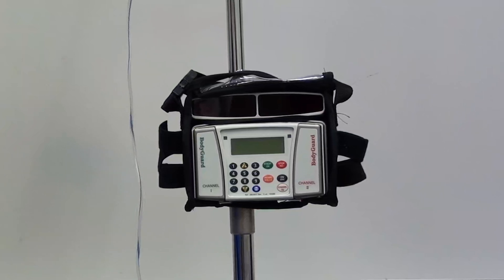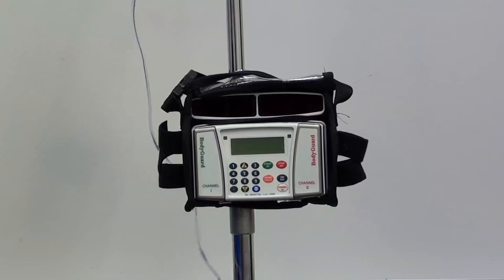This is the CME Bodyguard 121 two-channel pump. Today we're going to go over how to set up an administration for a medication, as well as looking at the proprietary pump tubing.